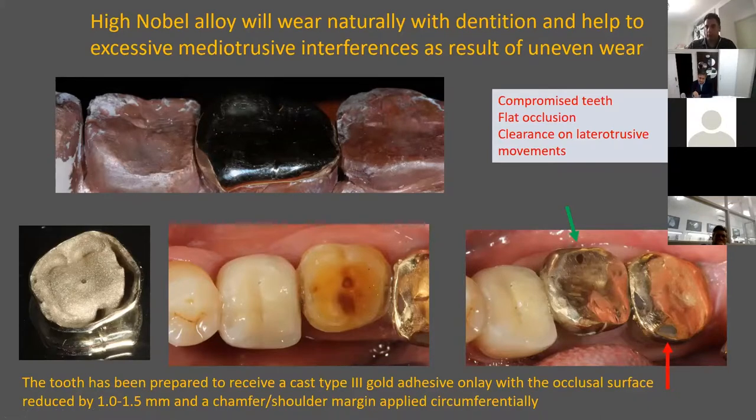With GHM4 articulating paper, where you press, the patient bites and you feel it's biting. As they move, you hold the pressure and then let it clear. Go back in and have a look at it. You can't see it if it's wet. Sandblast the tooth and you get better marking on articulating paper. You know exactly where it is, and that's how you get the marking, okay? I'm not used to electronic devices telling me where it's hitting. I like to feel things, and to me, that's very important.